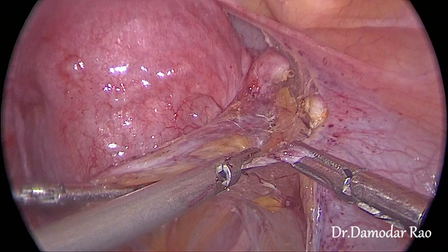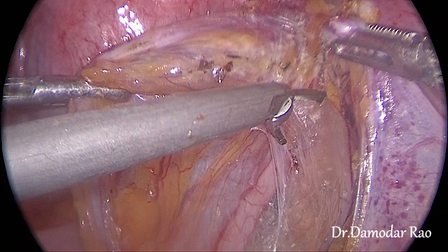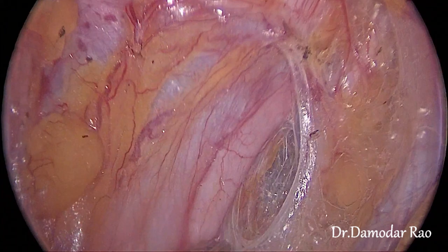As we go ahead here we cut what is called the rooftop fibers — basically the fibro-fatty tissue — so that the space becomes more clear and the uterine arteries can be exposed. Here I change the active blade away from the ureter so that it is protected and there is no heat transmitted to the ureter.